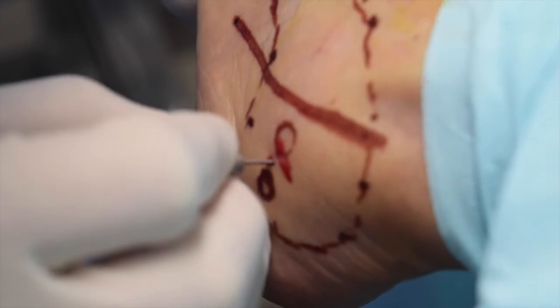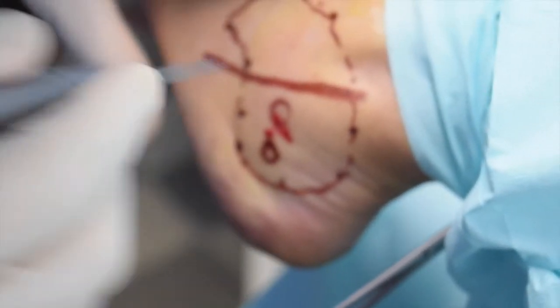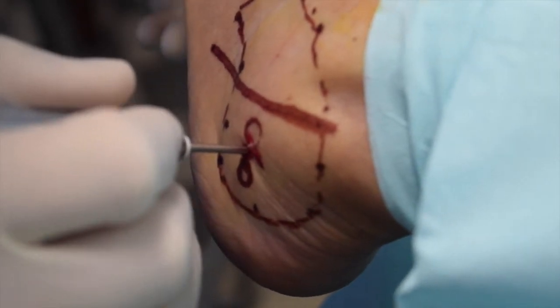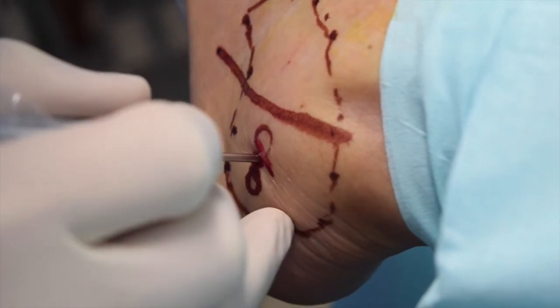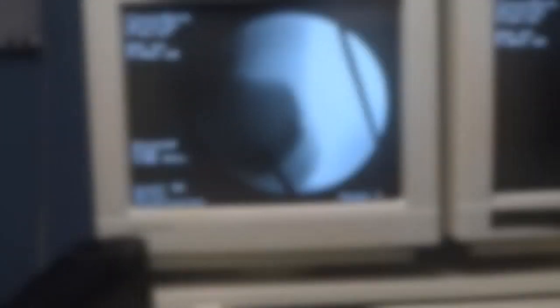We're going to make three passes into the heel to allow the decompression to take place. Once we have our landmarks, we make a percutaneous incision with a 67 or 64-00 blade, free some of the periosteal structures, and then take the Isham burr. Between the two areas where we have inflammation, we go directly between those two areas and make a drill hole just perpendicular to the surface — we go right through the cortex and back out. This is shown in slow motion with the burr.